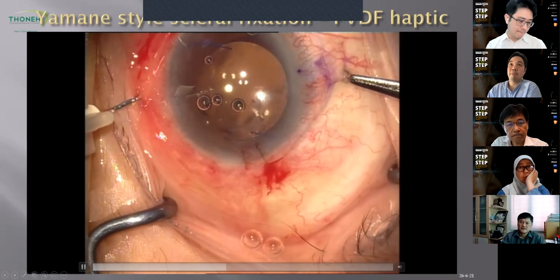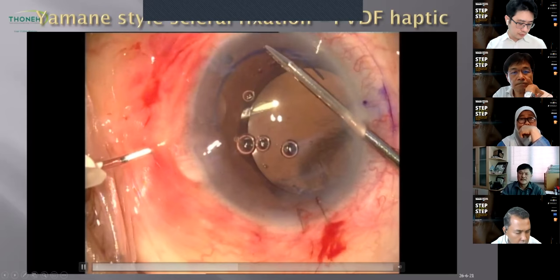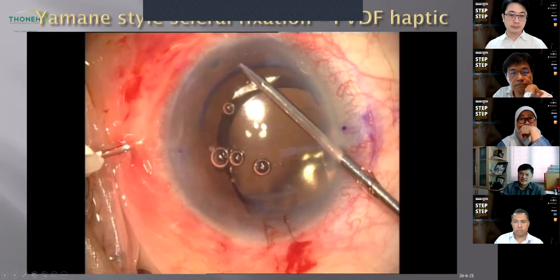Okay. So now I will use a 23G microforceps, go through the paracentesis, catch the haptic, and try to fit this haptic, the first haptic, into the hub of the 27G needle.